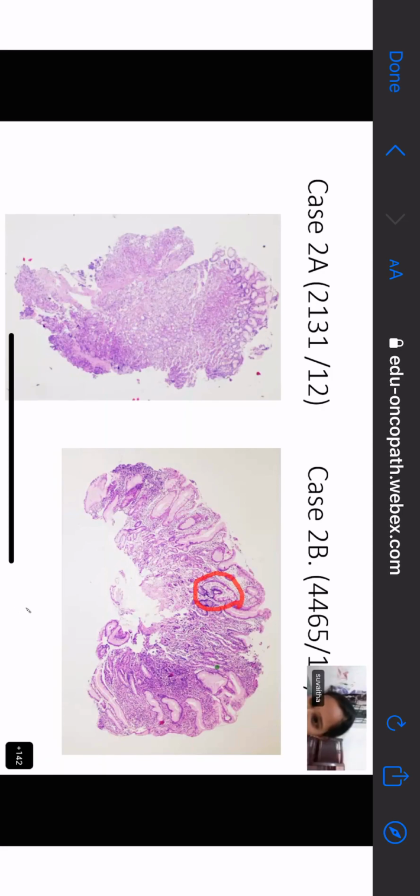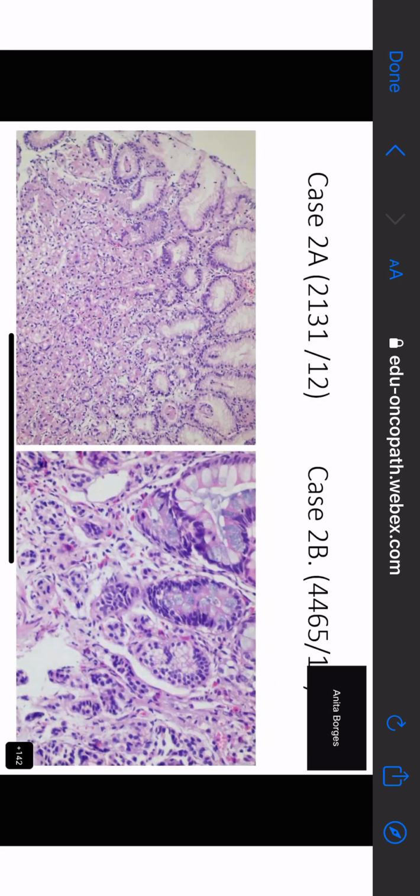Intestinal metaplasia, ma'am. Now, what do you mean by intestinal metaplasia? What are you seeing, Shweta? Goblet cells in the gland, which is so obvious. The rest of this foveolar epithelium is plain, simple, mucin secreting, non-goblet cell epithelium. And this one, a portion of the foveolar epithelium is sticking out over there, right in the center, and it has got goblet cells.